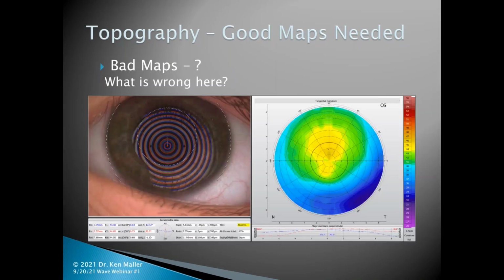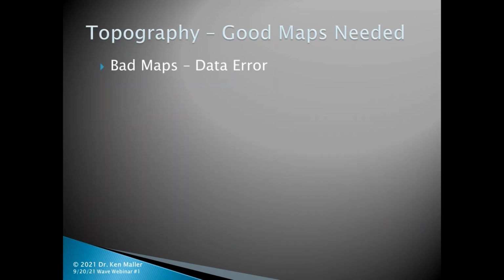And I put them up here. Oh, I'm sorry, this is one more map. I'm sorry, I forgot that I had this one. Here's another keratograph map. This is a little bit of a strange one because it looks like it's a superior cone almost, because we have all this superior steepening. All right, so let's go over here and take a look.